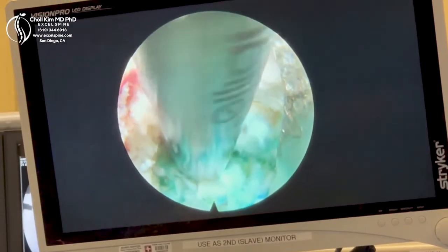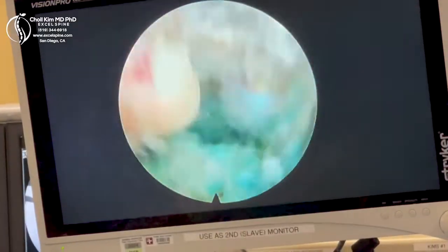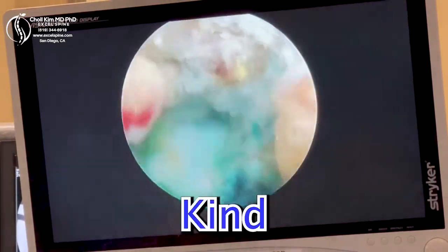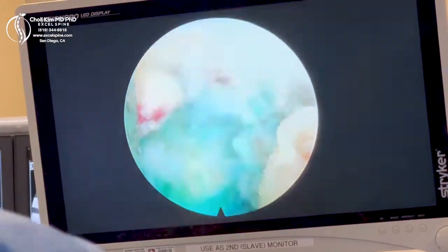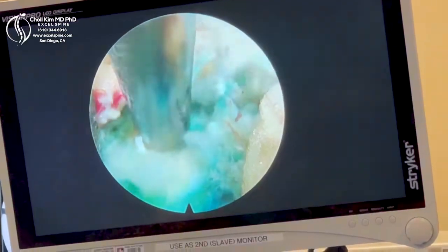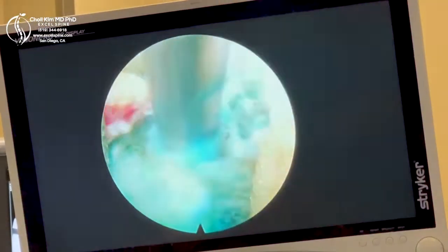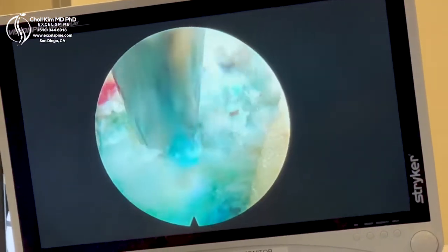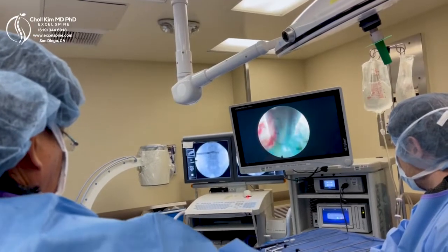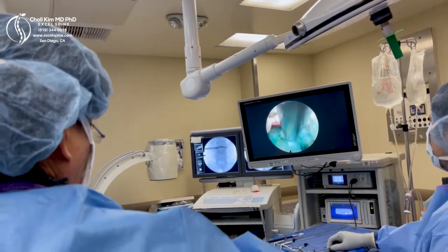Pathetic — but it's not you, it's your disc. No judgment. Getting all the loose pieces out — look at that. That should not be there. That's the thing that perpetuates the problem. That's where the exiting nerve root is — look away, look away. I'm going to be very gentle and kind to anything that's not a disc. It's wanting to just squirt out. Oh yes. I'm finding all kinds of badness — that tells me you're going to get better, or I'll eat my hat.